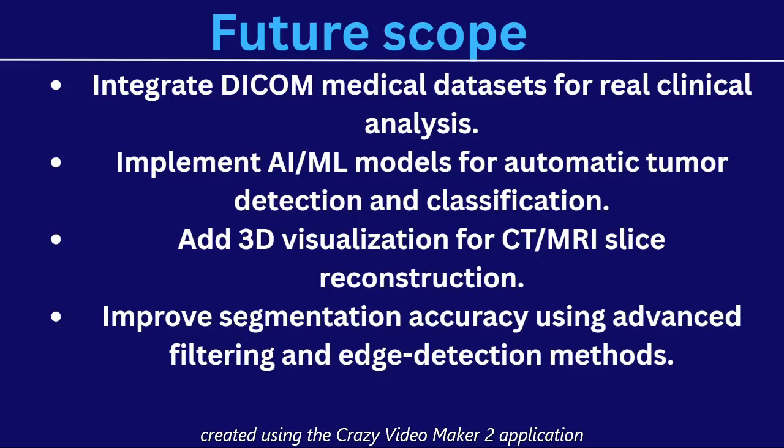Multimodal healthcare. The integration of imaging with genomics, EHRs, and wearables will give a complete picture of patient health. Remote and accessible diagnostics. AI tools can help provide radiology support in rural or resource-limited areas. New technologies. Transformers, federated learning, synthetic data, and explainable AI will shape next generation medical imaging systems. Growing clinical adoption. More AI-powered devices will be approved and used directly in hospitals and radiology workflows.